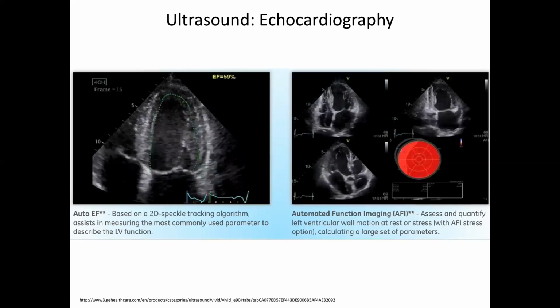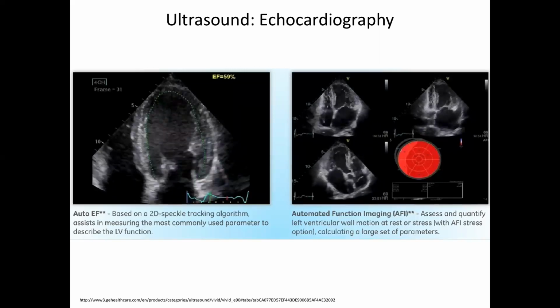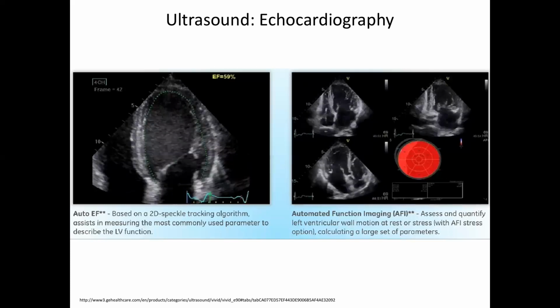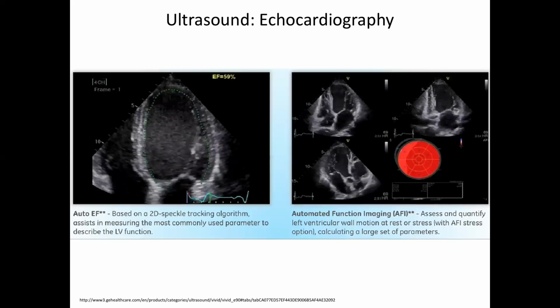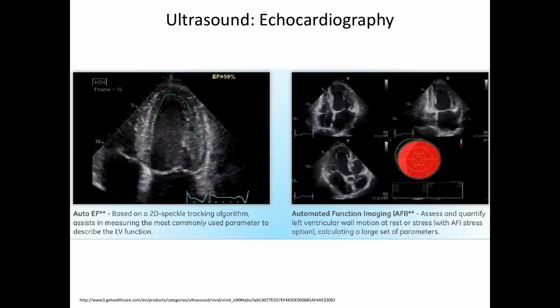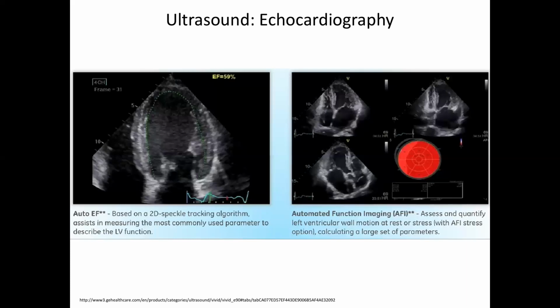So what is done mostly is experts look at the movie. They don't bother drawing contours and stuff. There are people here at UCSD, like Dr. Tony DeMaria and people like that, who probably looked at 100,000 echoes, right? And so when they just look at the movie, they just know what's happening, right? They've seen it before, they know what's going on. Their deep learning set is huge, right? And so they've iterated to being able to see it. I trust that way more than I trust people drawing contours.